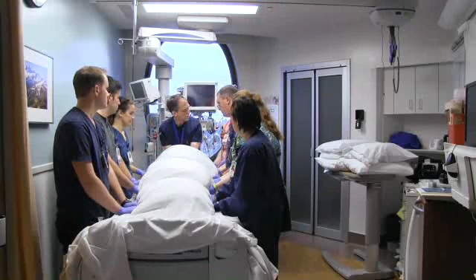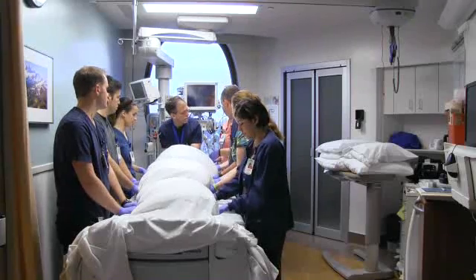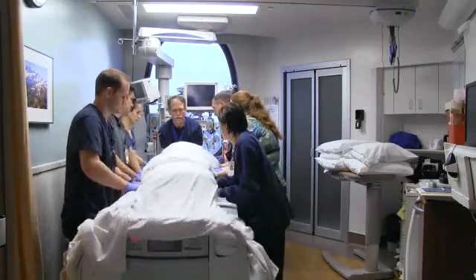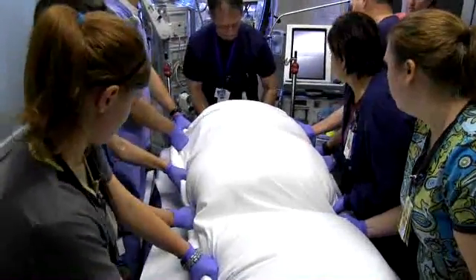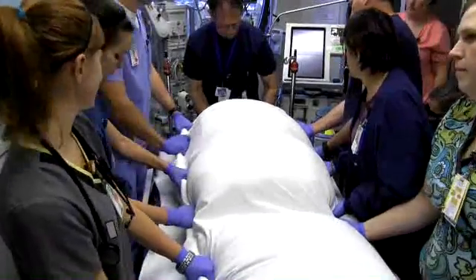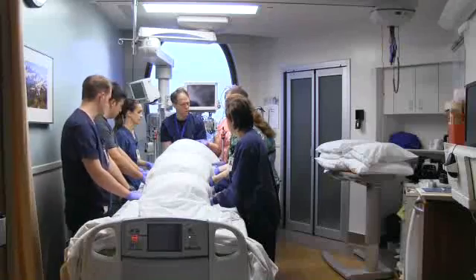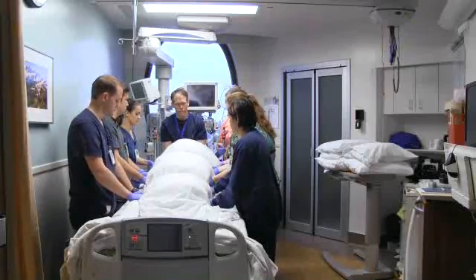On the RT's count, we're going to go straight up so that the patient's head is actually hovering over the head of the bed. On three — one, two, three. Once you get to that position, the next step is to slide the patient laterally away from the ventilator. On RT's count, away from the ventilator — one, two, three.